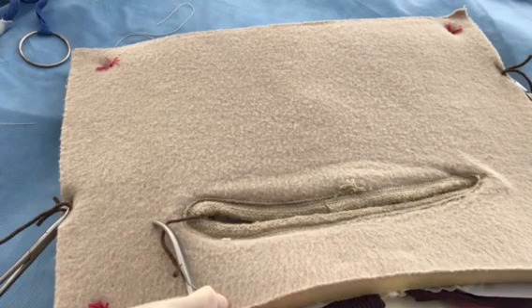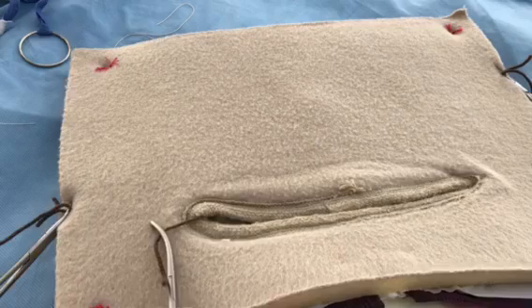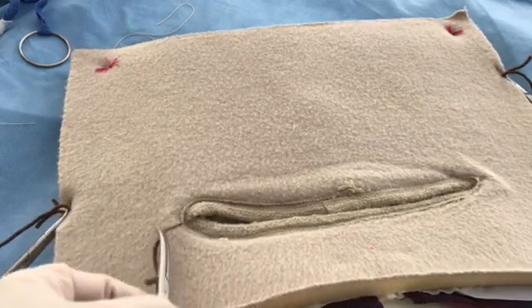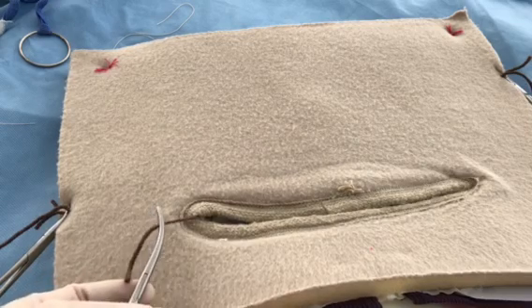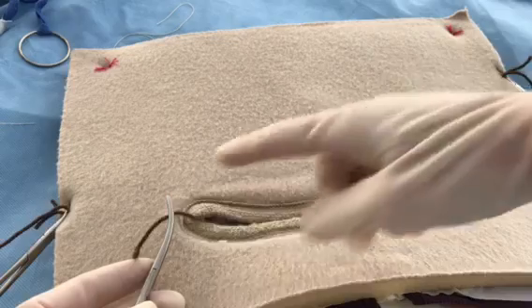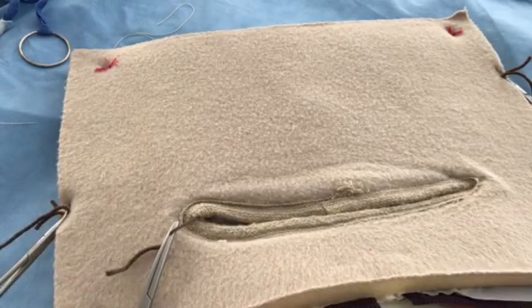This is Nell Tharp and I'm going to demonstrate a suture ligature. This is used most commonly in GYN surgery and the goal is to tie off a vessel, using a suture that is anchored in adjacent tissue.